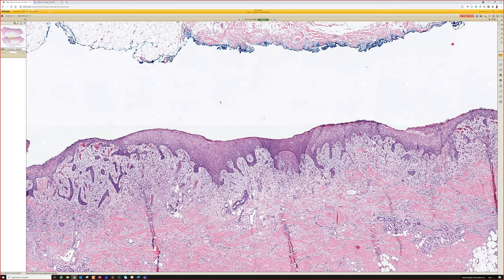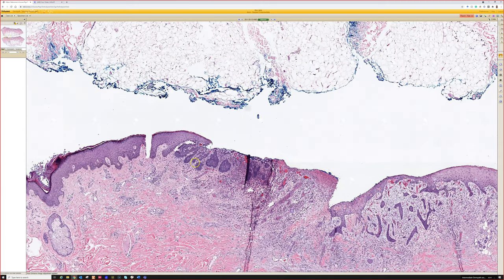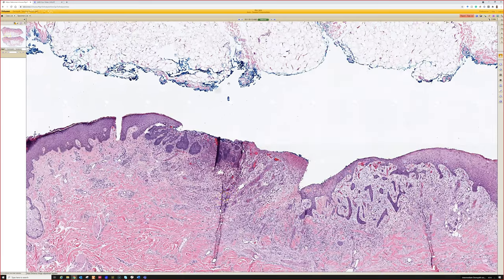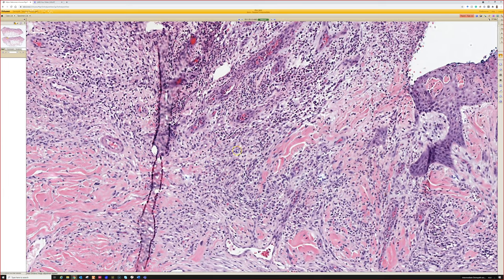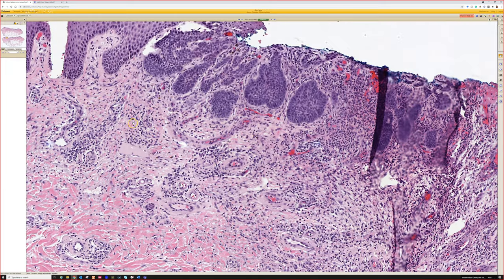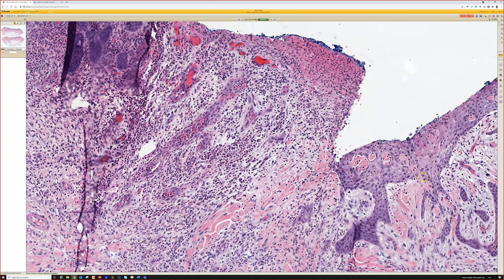So sometimes if you're not given the history, it can be challenging and you could get really concerned about these islands of epithelial cells here. In this case, we've got residual basal cell, which tells us, oh, this must be a re-excision of a biopsy site. The other thing we can look for is those little histiocytes that have the bluish gray cytoplasm that are filled with aluminum chloride. I don't know if we have them in this case. And that only works if the previous biopsy had aluminum chloride applied afterwards. But when you see that, that can help.